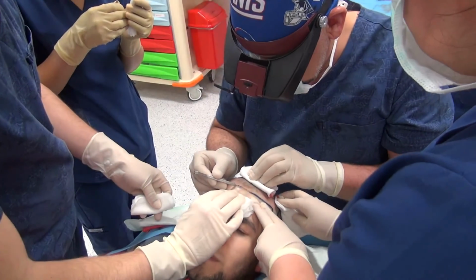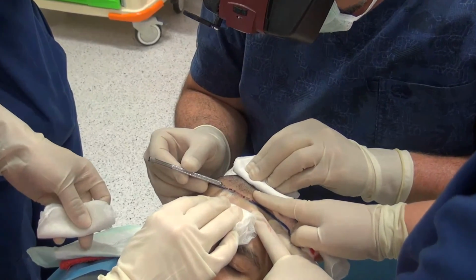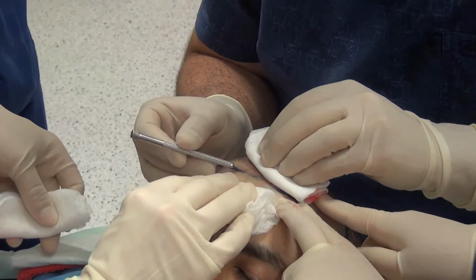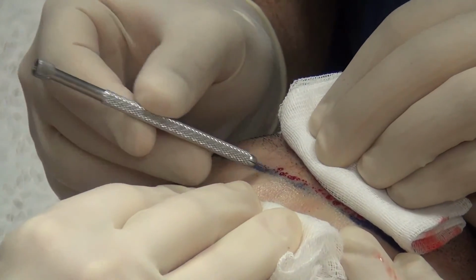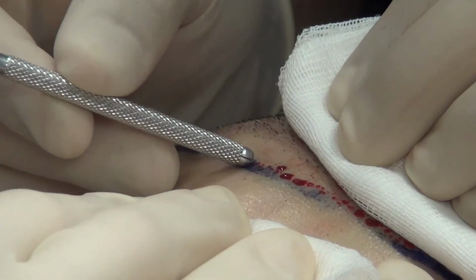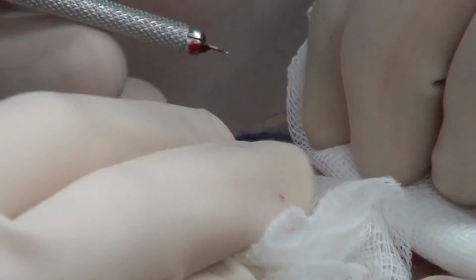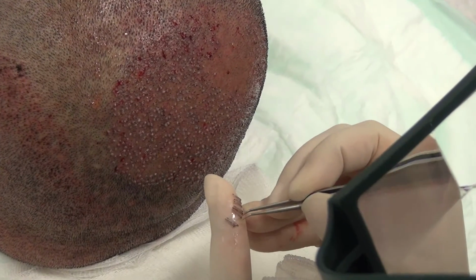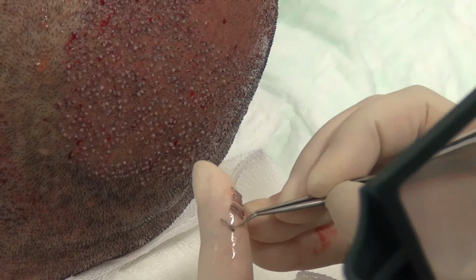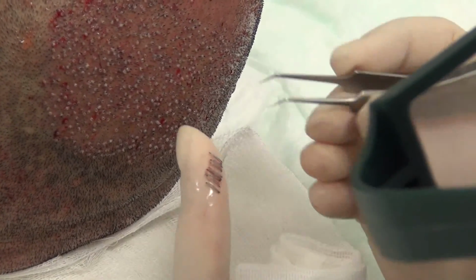I prefer coronal-oriented incisions with blades 0.1 mm bigger than the extraction punch size. Mostly 300 to 600 single hair follicle grafts are enough for the front line area. One of the main points is that every graft has its implantation site. During the replacement, we should take care to use the same direction of the follicles as in the donor site.